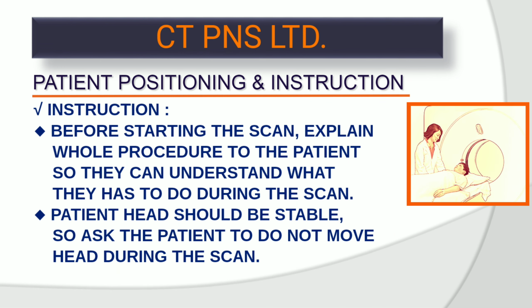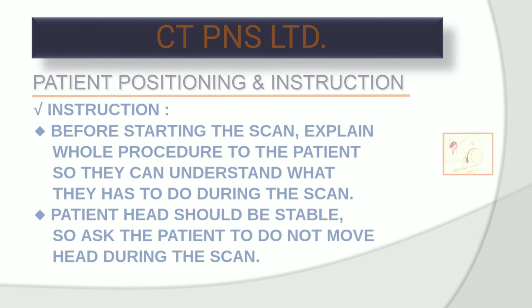Instruction: before starting the scan, explain the whole procedure to the patient so they can understand what they have to do during the scan. Patient head should be stable, so ask the patient not to move the head during the scan.